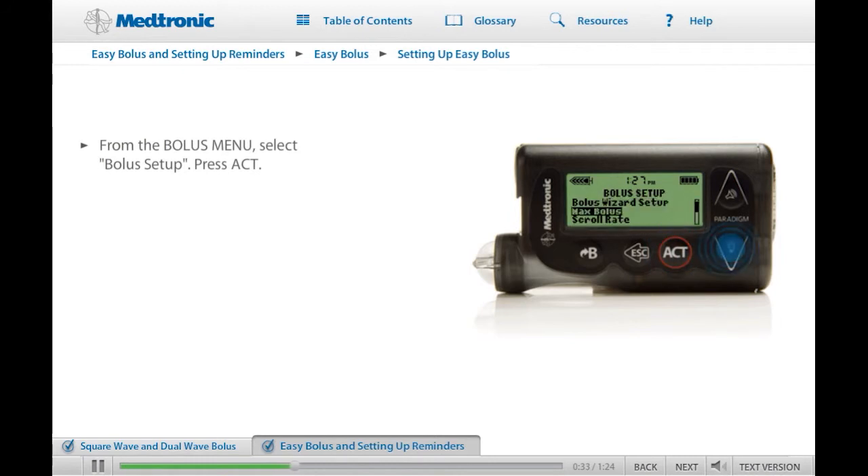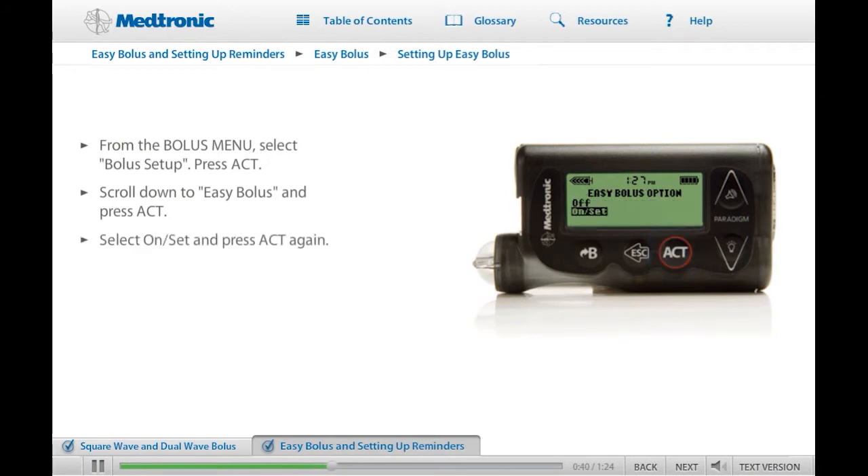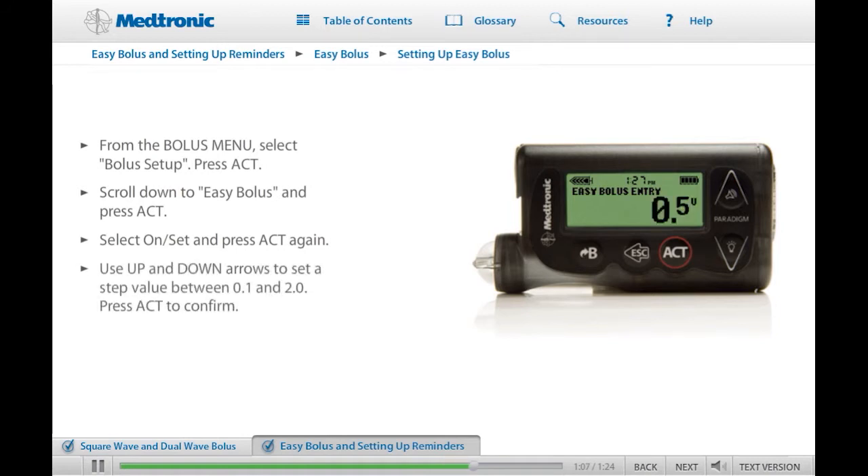Then scroll down the Bolus Setup menu to select Easy Bolus and press Act. Select On Set and press Act again. The Easy Bolus entry screen will appear. Now you are ready to set the Step value — the number of units added to the bolus amount each time you press Up. You can use any value from 0.1 to 2.0 units, but be sure to make it a number that is convenient to use and easy to multiply. On the Easy Bolus entry screen, enter the value you have selected and press Act.